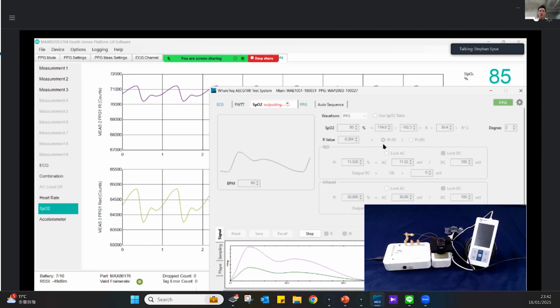Then you can use the same curve to calibrate the rest of the devices manufactured in the same batch, so the performance of these devices can be consistent with the golden sample. This is how the quality can be controlled. Right. So we managed tuning to 95, 90, now even 80s.